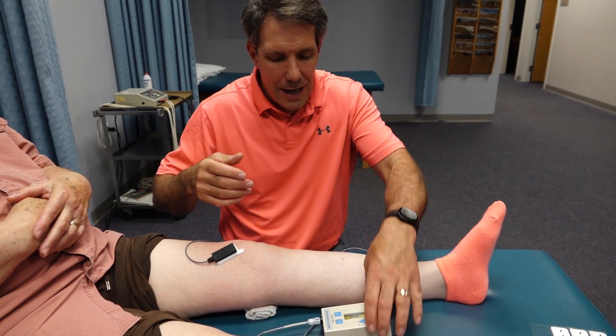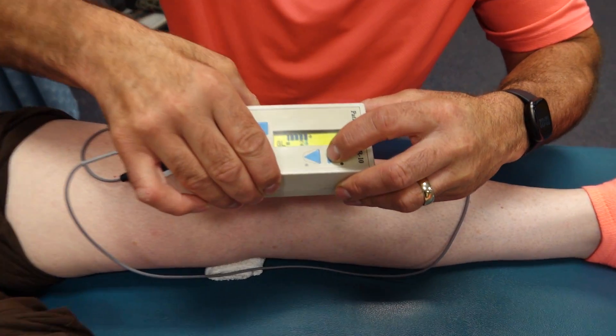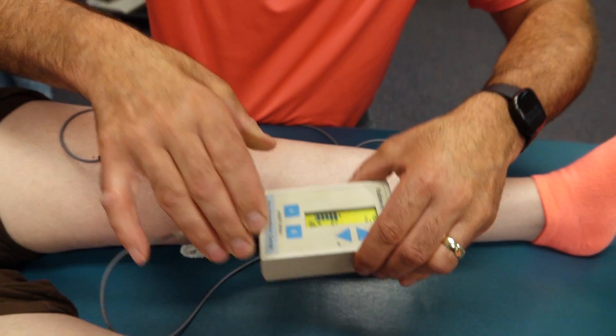At first, she might learn how to start to contract, and then I can take the goal and change it — move that arrow a little — so we're going to challenge her a little bit.